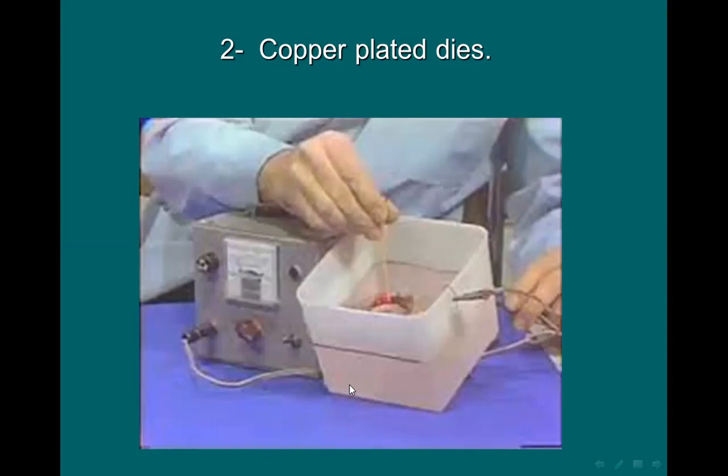You can see that the impression is placed inside the cell and the solution is covering it.